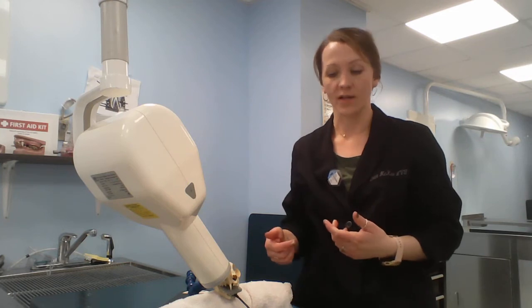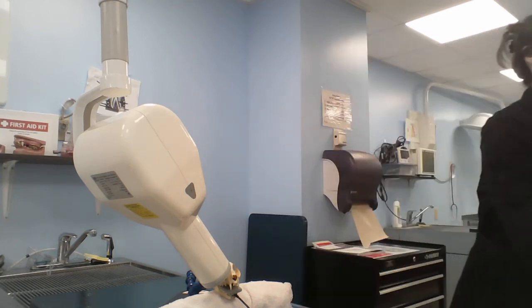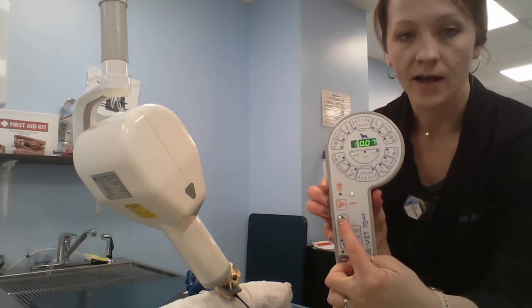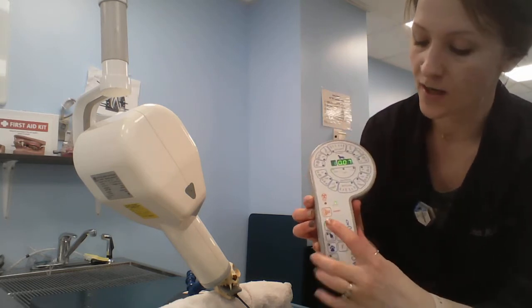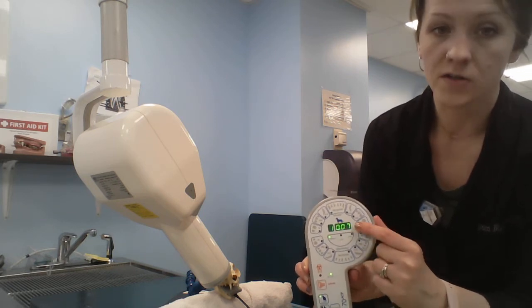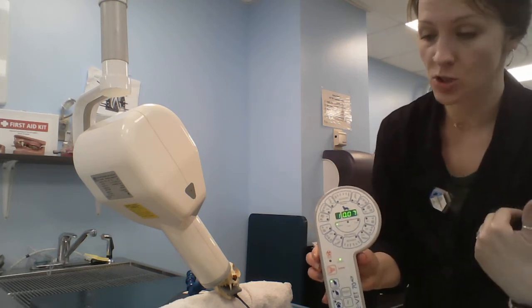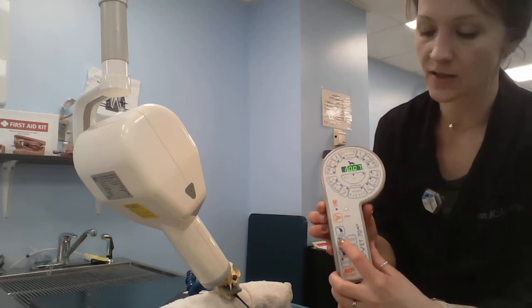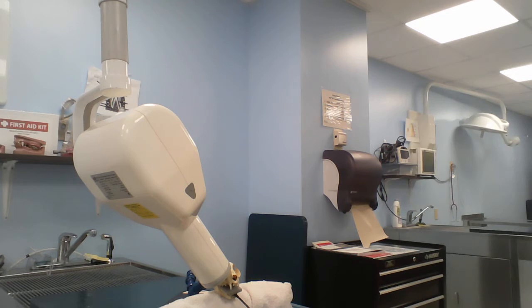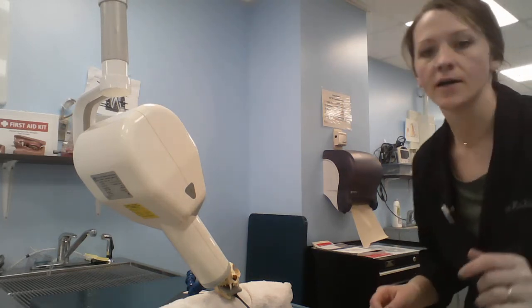We will expose. On your control panel, we're going to use these little icons, cat upper and cat lower. If we select cat upper, it sets our KVP and our MAS, so it'll stay this for the entire top jaw. When we move to the bottom, we'll go to the cat lower, and that will drop our MAS just a little bit. So remember, we're going to get 6 feet out of the way. Expose. And then look at our view on the computer.